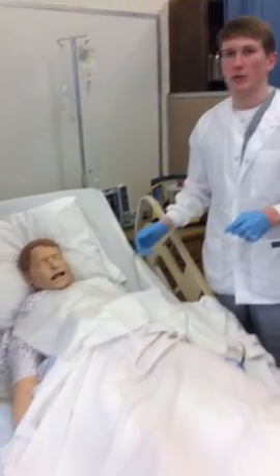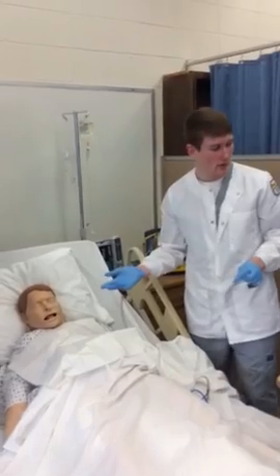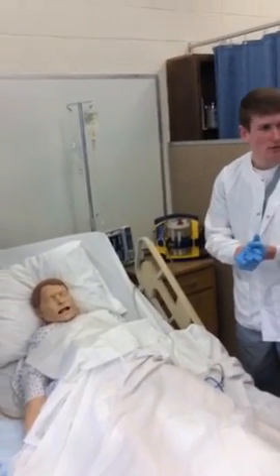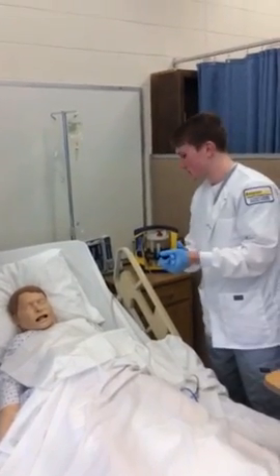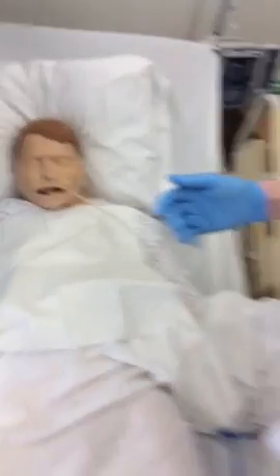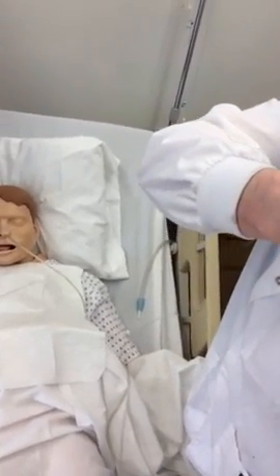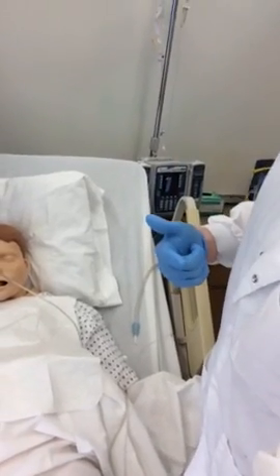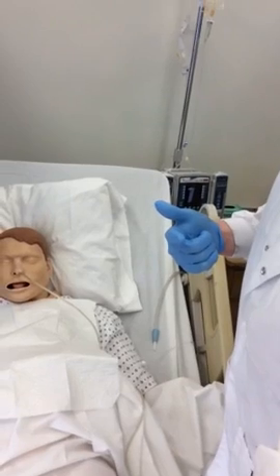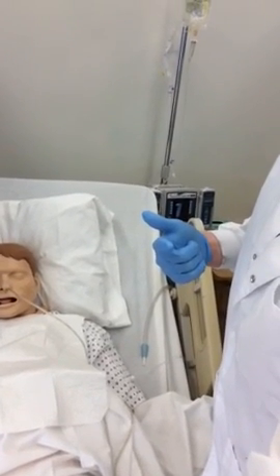Okay, now immediately when I do that, I'm going to check my placement first by looking at any signs of respiratory complications. And where's my... Let me see that real quick. Can you grab that syringe, it's over there, the syringe and measuring cup. Where's that? Syringe and measuring cup.